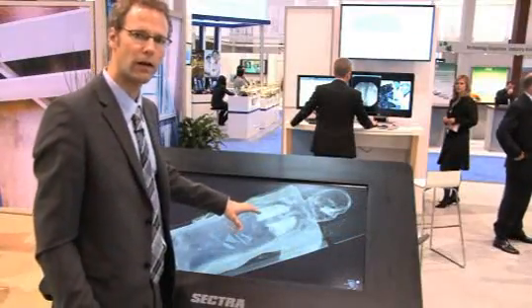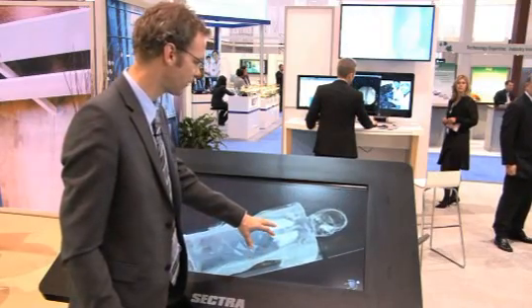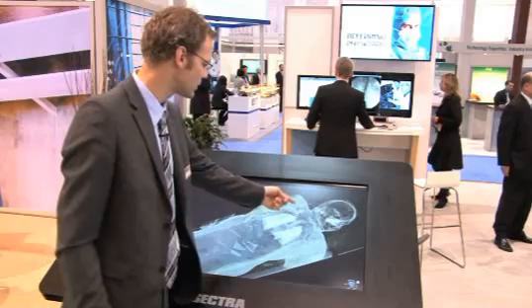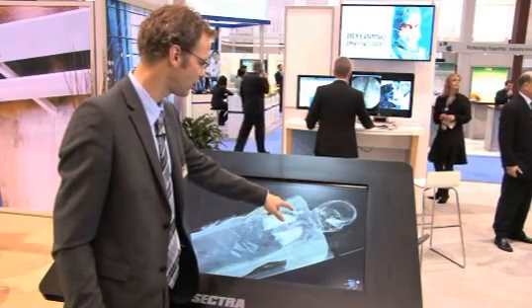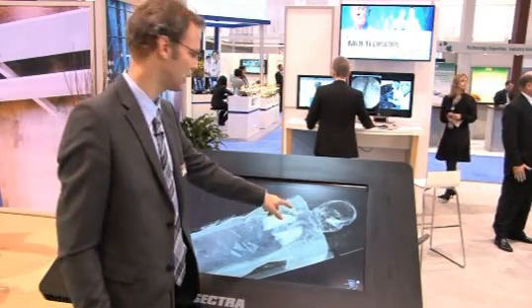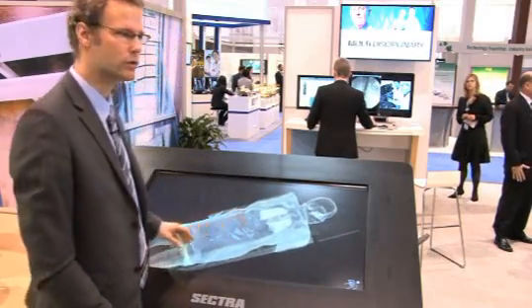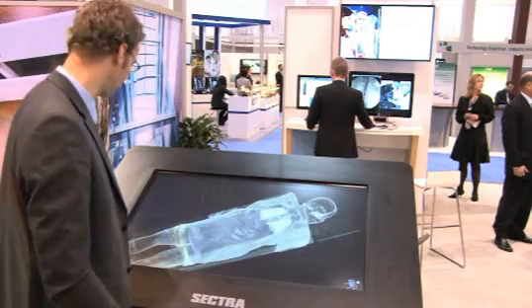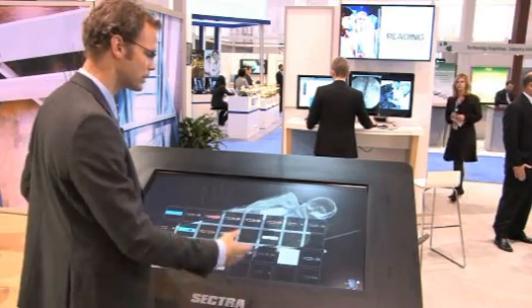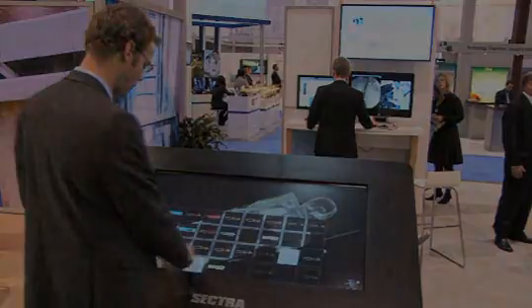I turn on the air presets and can see that the findings with the stabbing in the back are strengthened by the finding of a lot of air in his back and in his shoulder, where air shouldn't be. So this is a really useful tool to easily work through a set of presets to search for findings in bodies.